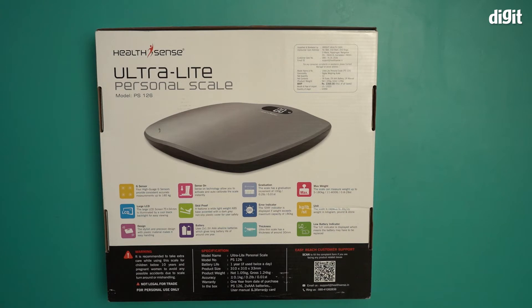The thickness — it's an ultra-thin scale with a thickness of around 30 mm. The maximum weight range is between 5 to 180 kgs. The scale is capable of displaying weights in kilograms, pounds, and stones, so it has three metrics you can program depending on where you live.